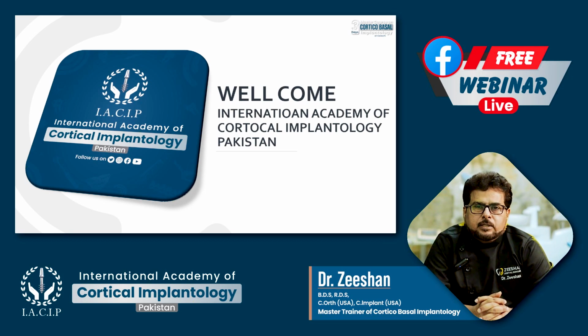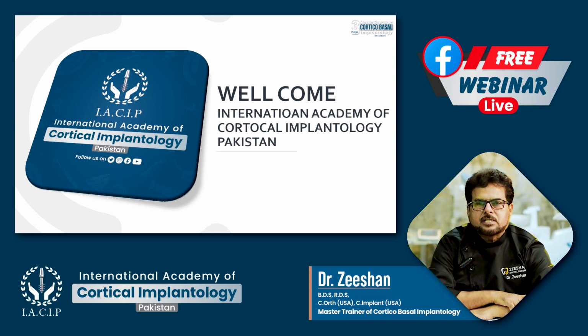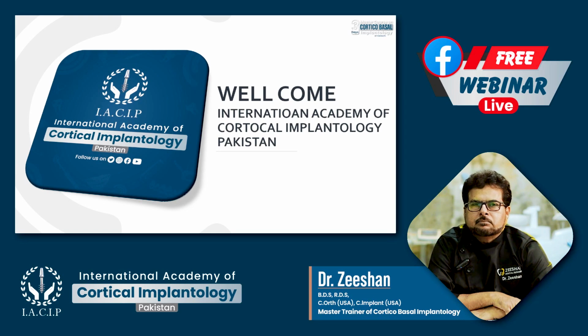One of the factors is bone implant contact, and as we have less bone in resorption cases, we are choosing patients with less bone. So how to place the implant? Longer implants achieve large bone implant contact. Large bone implant contact is going to provide us increased primary stability and high torque.